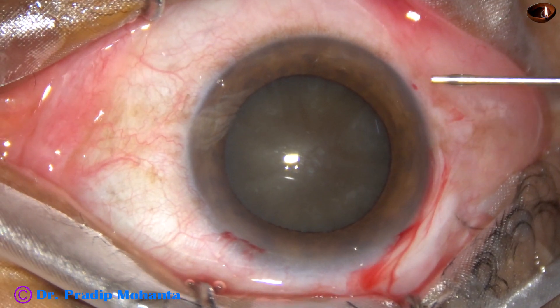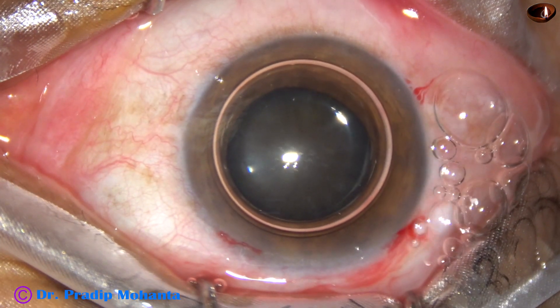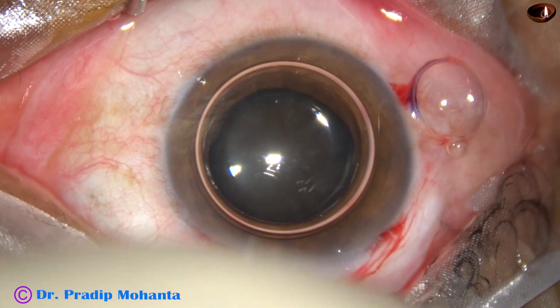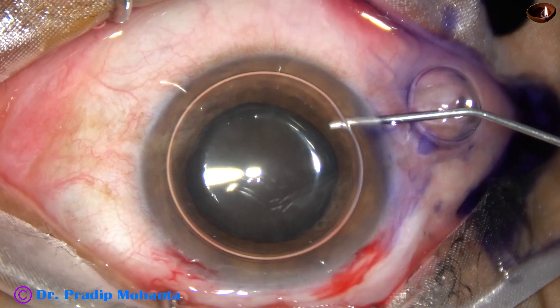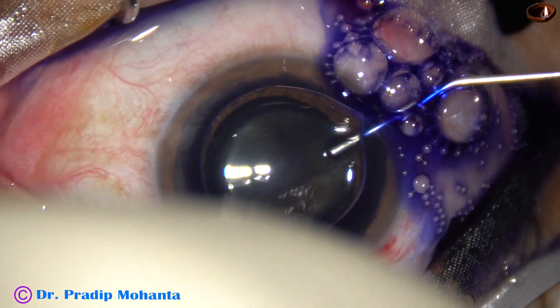I am going to stain the anterior capsule of this hard cataract with Trypan Blue dye. This is Trypan Blue 0.06% dye being applied over the anterior capsule underneath this air bubble.